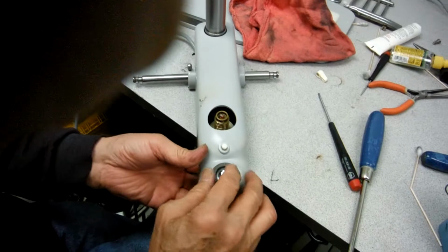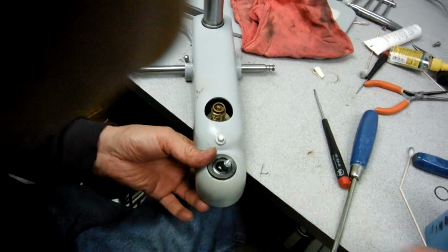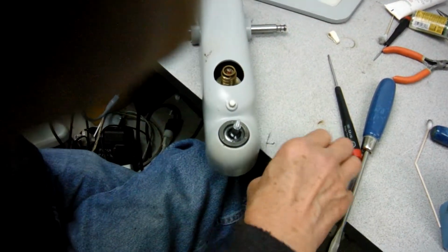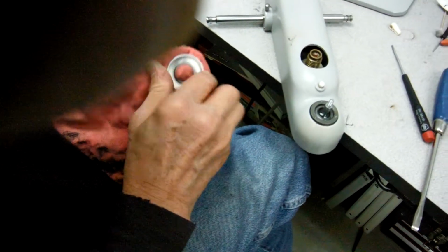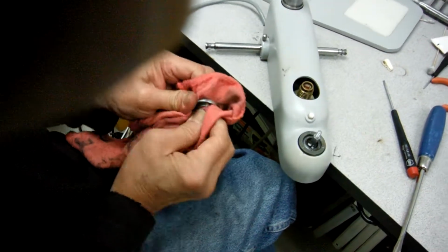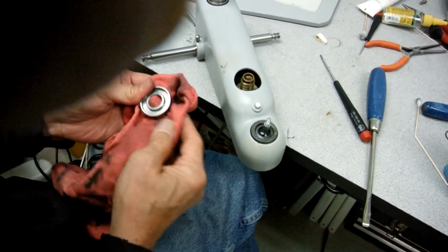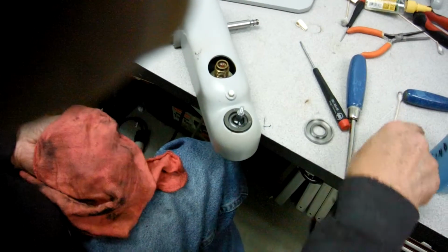Okay, after you put that one in there, and then you can put the lock cover, clean it out good, and put it back there.